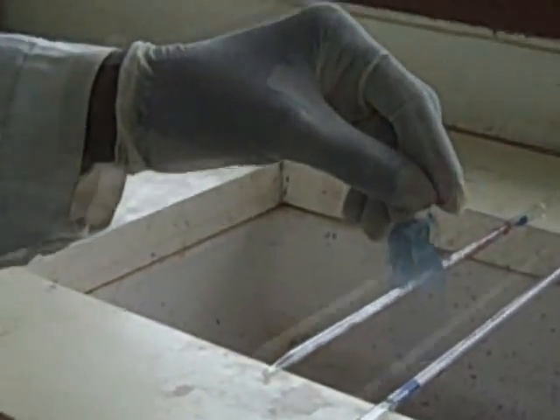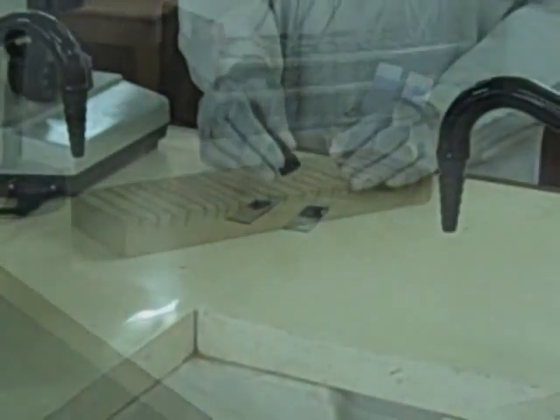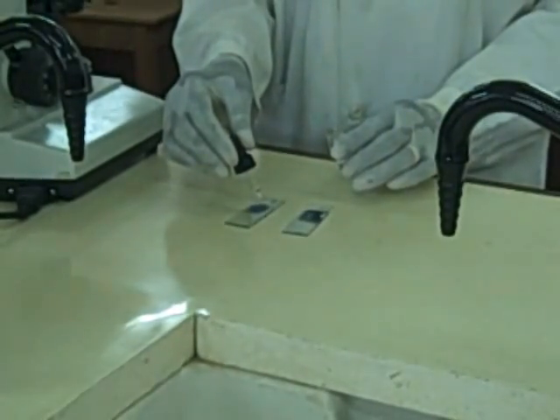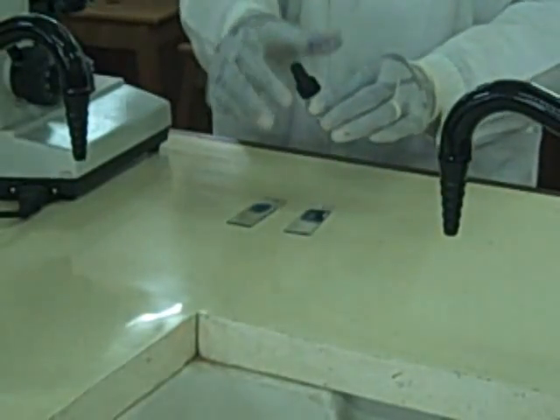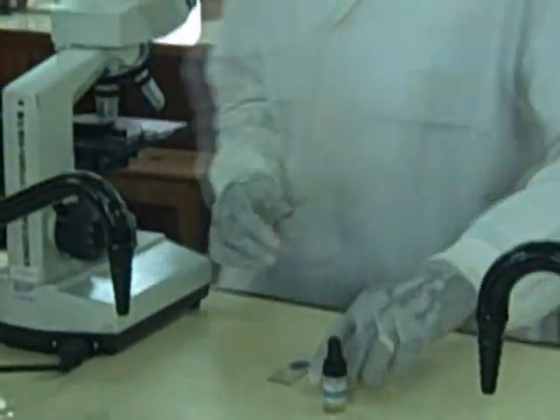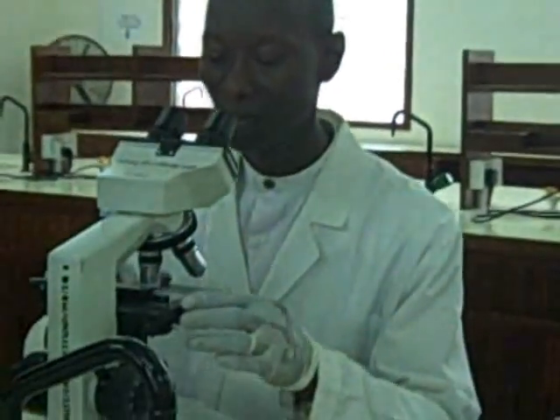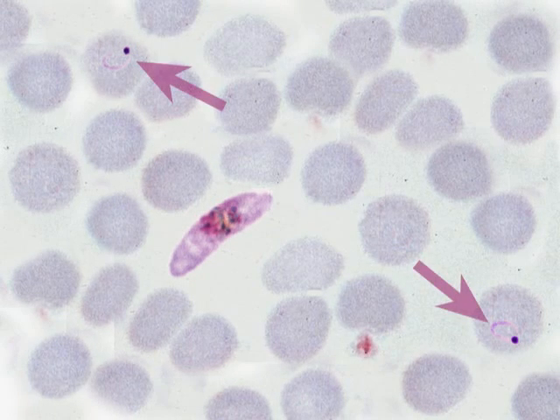Wash the excess stain under tap water or buffered water and air dry on the draining rack. Examine the thin smear under times 100 using oil immersion. For the thick smear, you expect to see the parasite and the white cells. The parasite will look like a ring form or dots which appear in pairs. In the thin smear form, the parasites are found inside the red blood cells, which can be used to determine the species of the parasite.